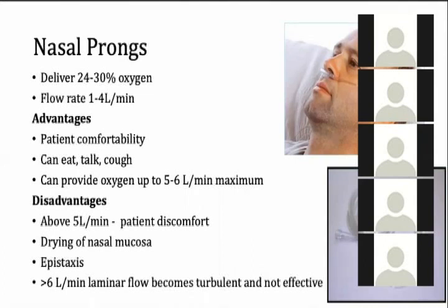It can deliver only about 24 to 30% oxygen, and the flow that you use is about 1 to 4 liters, not more than that, because it is put into the patient's nose, and a very high flow rate would be very uncomfortable as it is directly delivered into the nose.